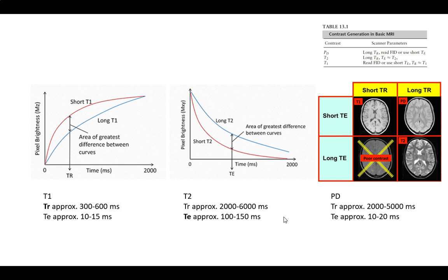If you've got edema or whatever else, fluid buildup, right? So generally bad stuff is associated with extra fluid building up, even though it's not necessarily the fluid buildup that causes it, but it correlates highly with it. So it tends to make T2 brighter when you get more fluid and T1 darker when you have more fluid. So that's what you're looking for, tissues with those artificial perturbations. That's one way you can kind of tell the difference between them.